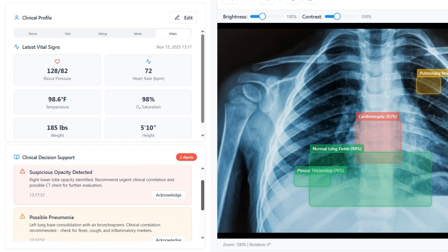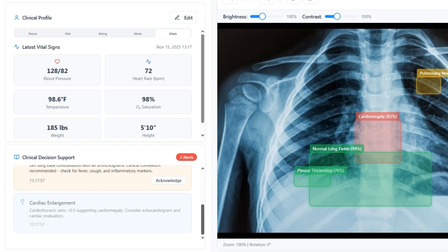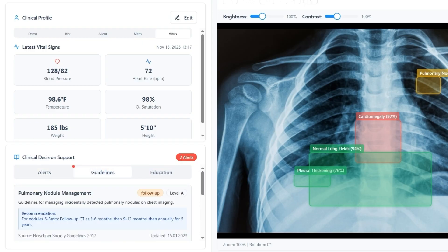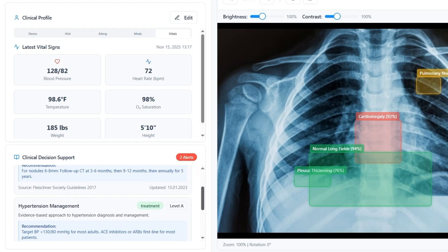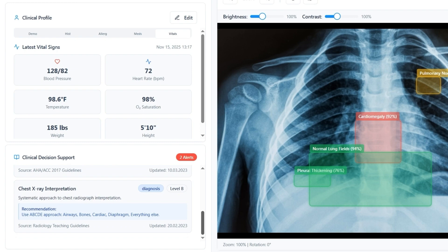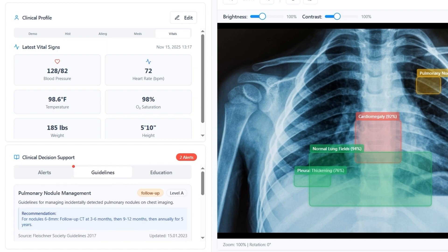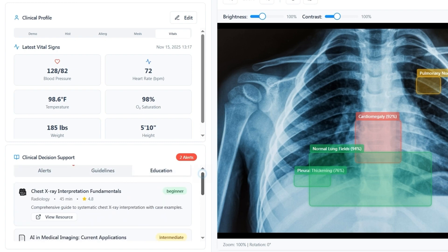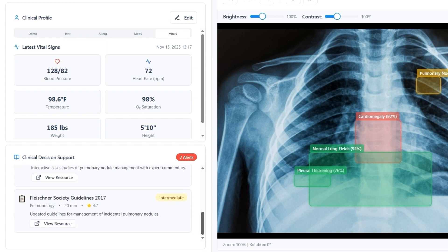Here they can also find the clinical decision support section with color-coded alerts, relevant references from clinical guidelines, and available educational materials on the subject.